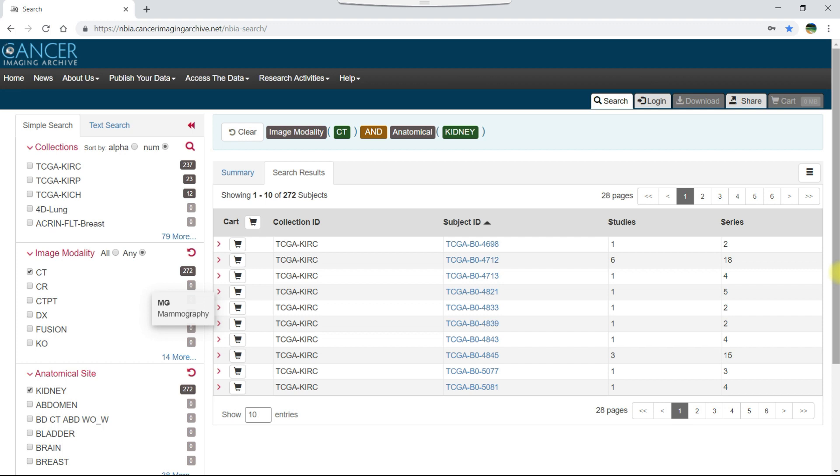For more information about the different ways to select the data you want, refer to our video on using the data cart that is listed in this video's description. Let's select a couple of the subjects in the search results and add them to our cart.